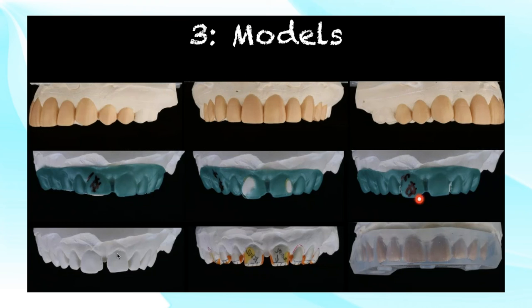And at the end is going to be that guide that I was speaking to you about, that clear matrix. So this clear matrix, we're going to be able to take it, put it in the patient's mouth, and show the patient how their smile actually would be.